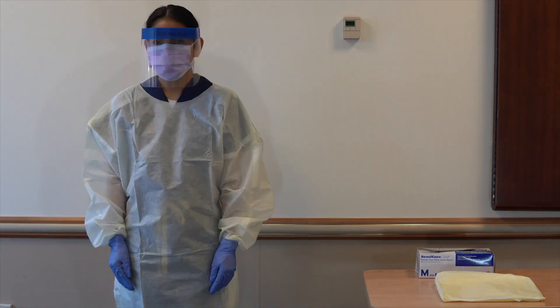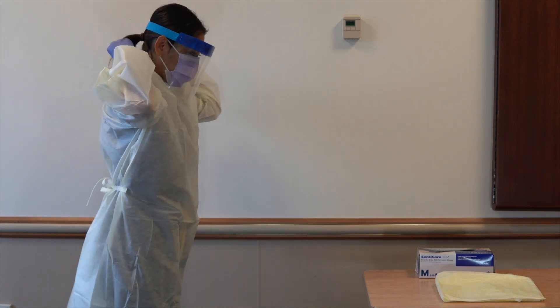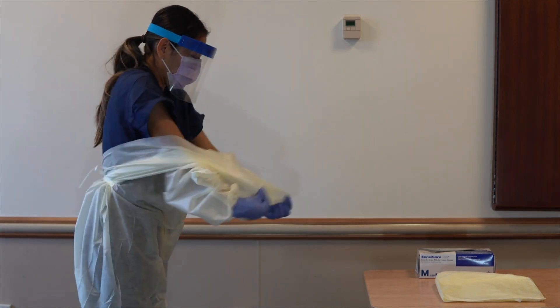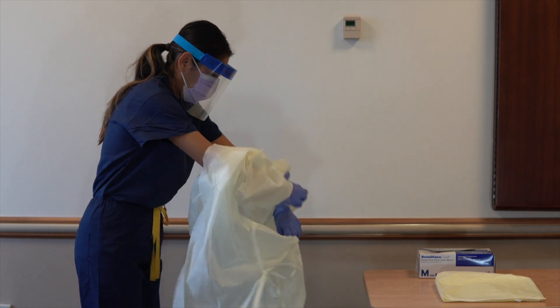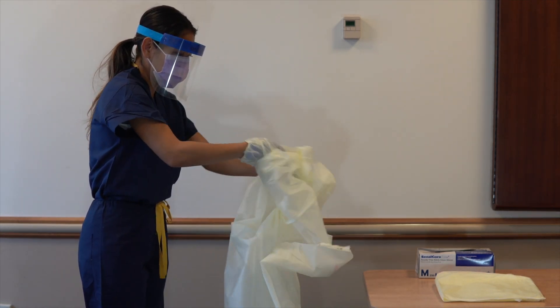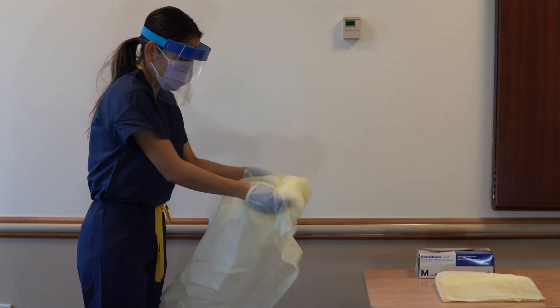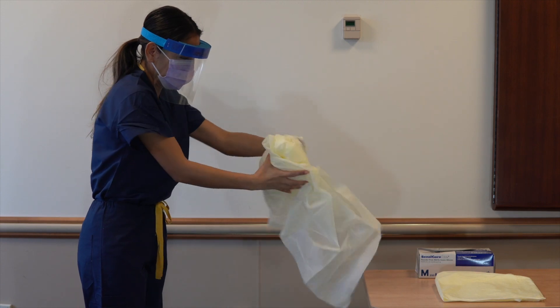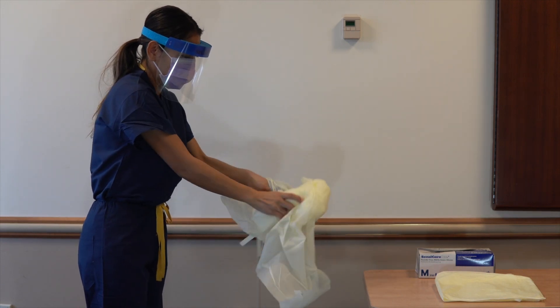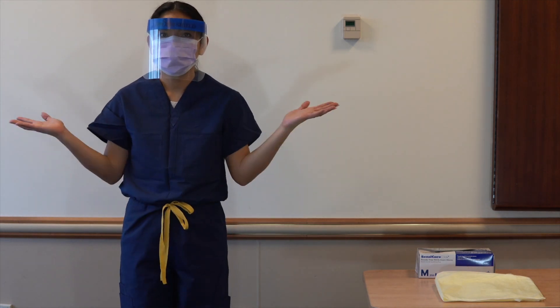While in the patient room or cohort area, doff gown and gloves. Grasp the gown in front and pull away from your body so that the ties break, touching the outside of the gown only with gloved hands. While removing the gown, fold or roll the gown inside out into a bundle. As you remove the gown, peel off your gloves at the same time, only touching the inside of the gloves and gown with your bare hands.